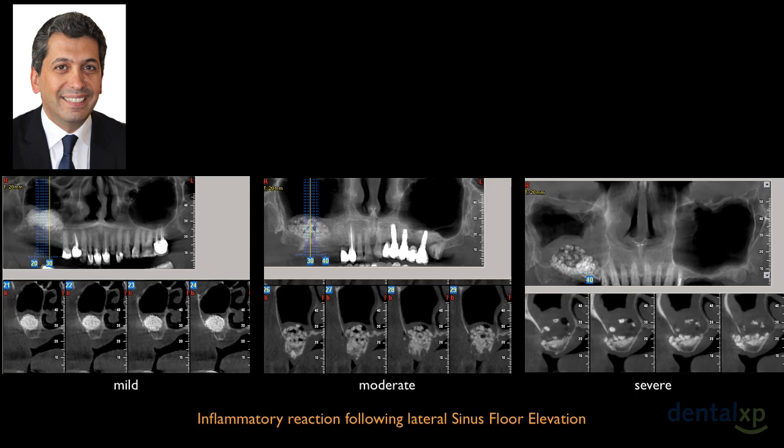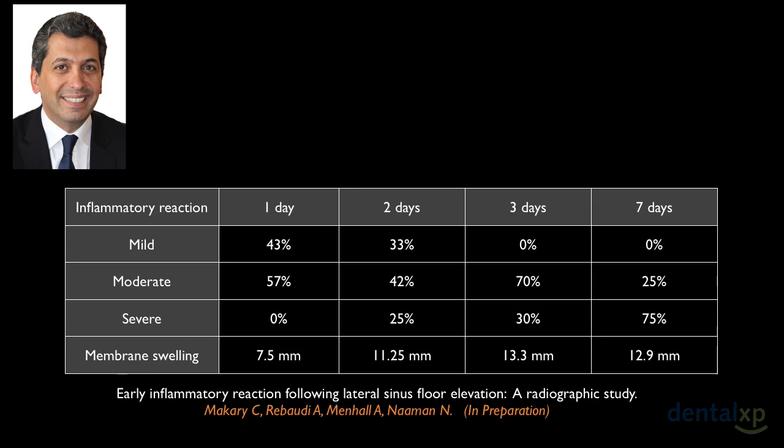And you can see that some of the grafting material is thrown outside the window, as if a type of hurricane occurred inside this sinus graft. So what we did is that we monitored this inflammatory reaction for different patients. And each patient who undergoes a sinus floor elevation had to do a post-operative CBCT in order to monitor this inflammatory reaction. For some patients, we did it at 1 day.